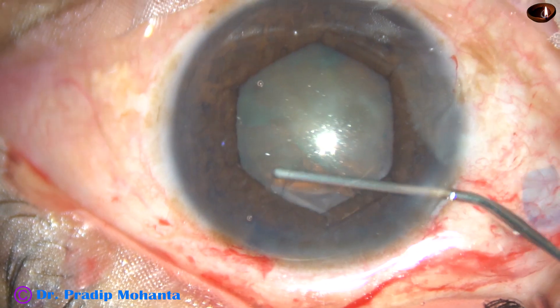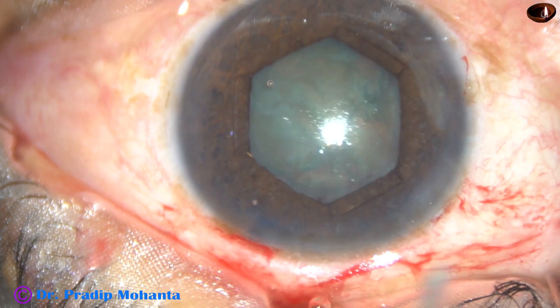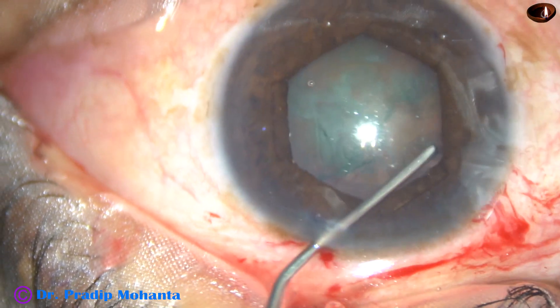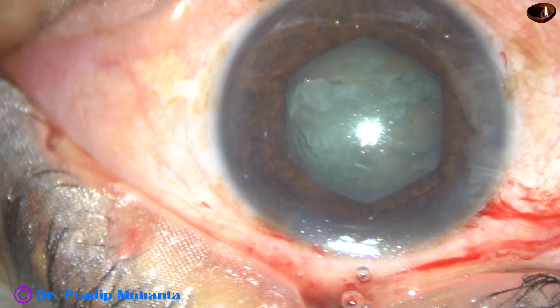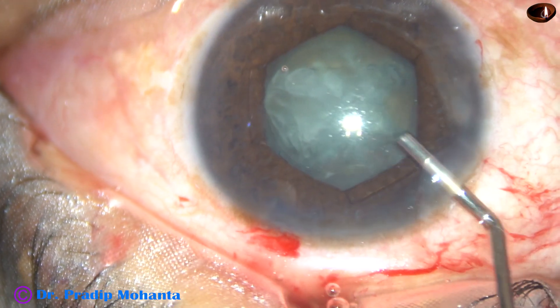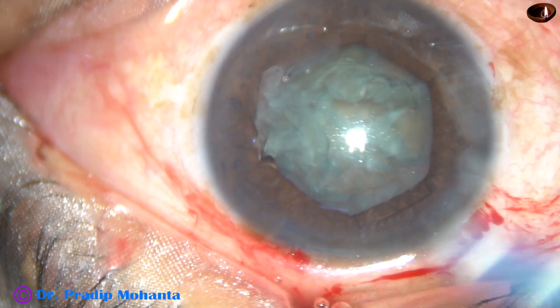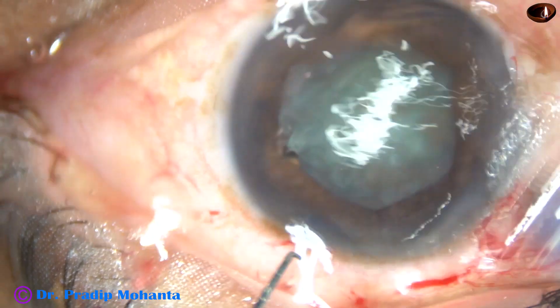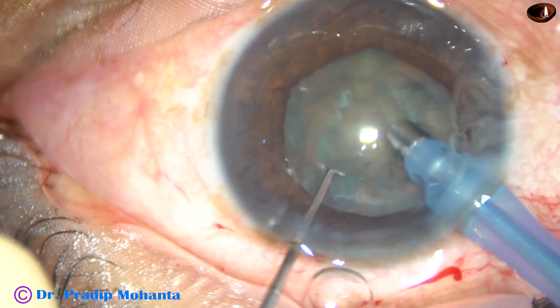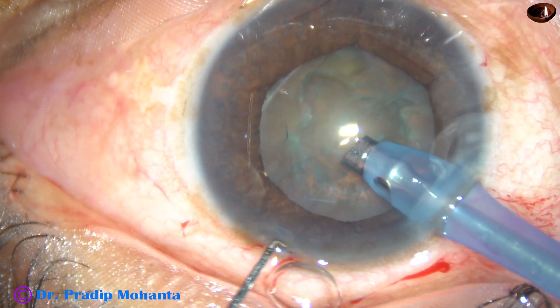Now hydrodissection. All these steps are just like a routine case after application of this pupil expansion device. And now the nucleus is being mobilized. Viscoelastic is injected again and now it's time to introduce the tip of the phaco handpiece. The titanium needle enters into the anterior chamber with its bevel down. Some superficial cortical matter is aspirated.